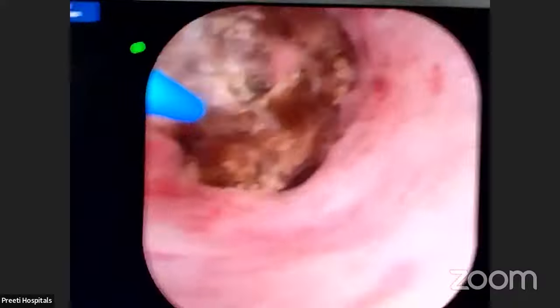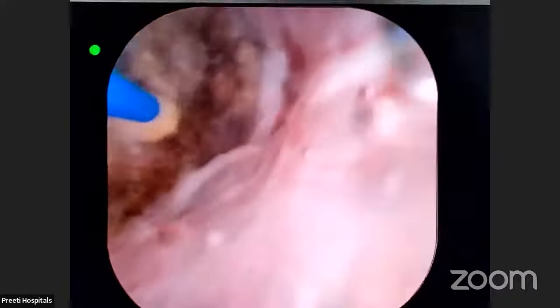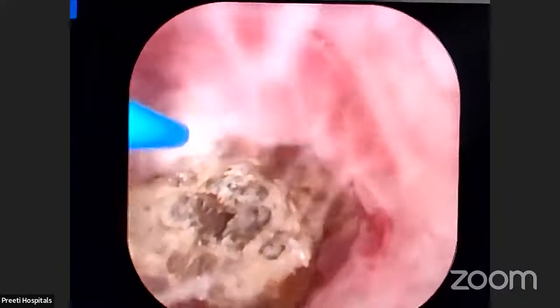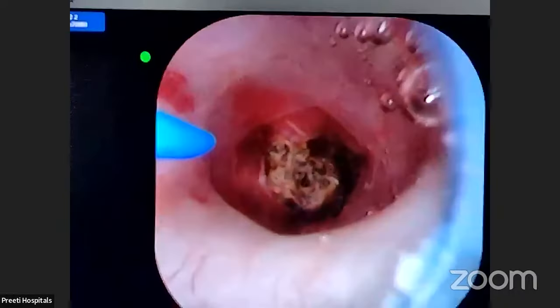My assistant Sridhar, this is an upper pole infundibulum stone, not an easy case for PCNL. Respiration control, upper pole. If you do spinal, it is difficult. So my anesthetist will control respiration, and I am making powder. See, whatever powder is there, it is sucked. See, almost I am in the powder. No powder will be seen.